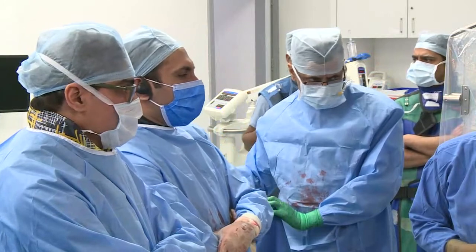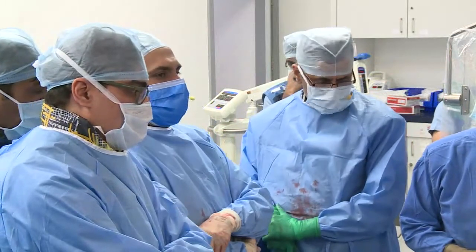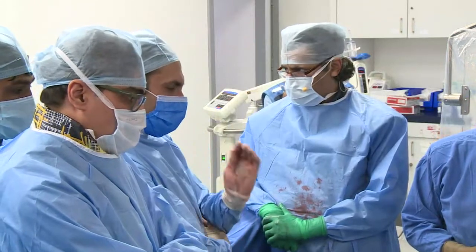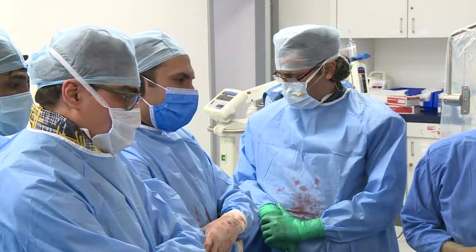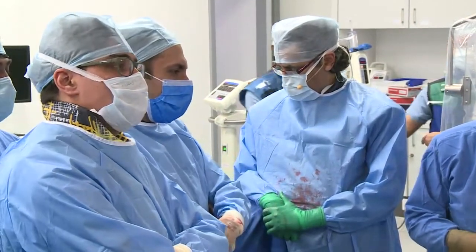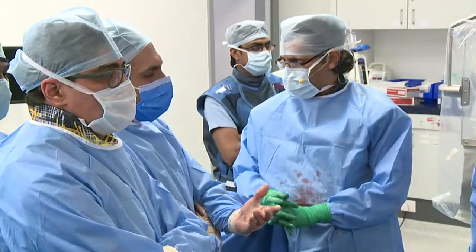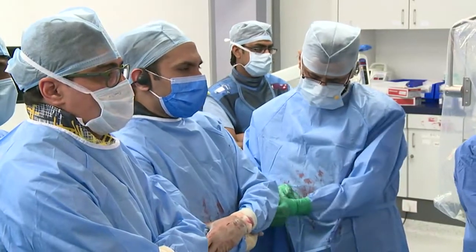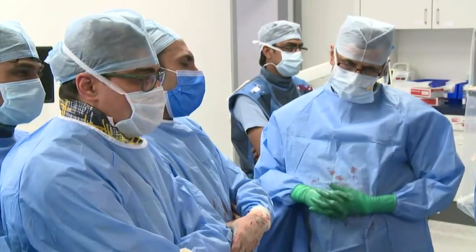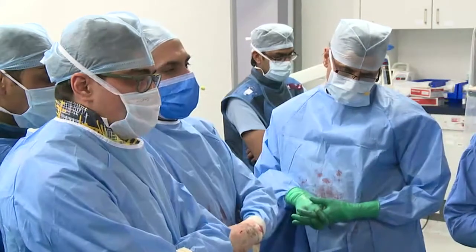But sometimes in a difficult position, when the patient has severe TR and the tricuspid leaflet, we have used a Mullins sheath. A Mullins sheath, if you place it into the RV, can keep the pacemaker lead stable in patients who have tricuspid regurgitation and if there is an issue with the stability of the lead. So it's a good idea to use a screw-in temporary lead. We don't use it. We don't have it here. But some centers use a permanent pacemaker fixation lead. So I think one can use it, but we don't use it anyway.